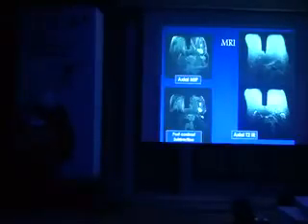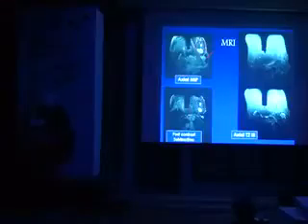The MIP, the subtracted images, and the inversion recovery images. So, let's count together. This is 1. We said the breast is one anatomy. 2, axillary lymph nodes. Sorry? Contralateral axilla. Okay. What? Yes. Very clear. We have 1. So 3 now. Are we satisfied with 3?